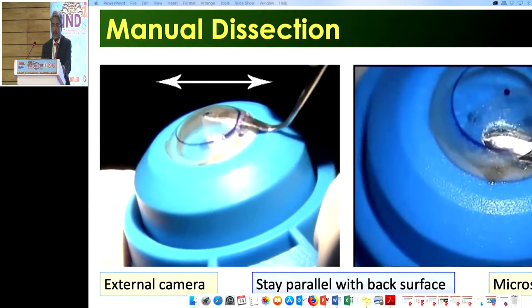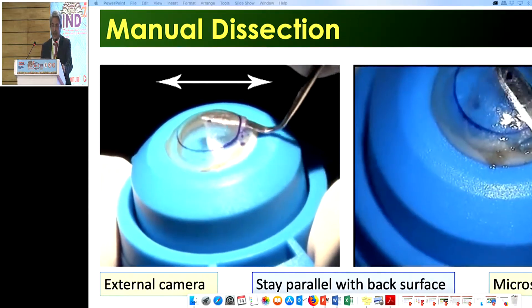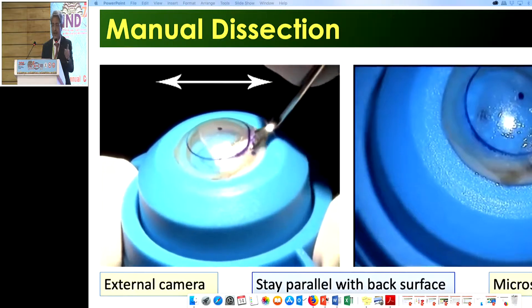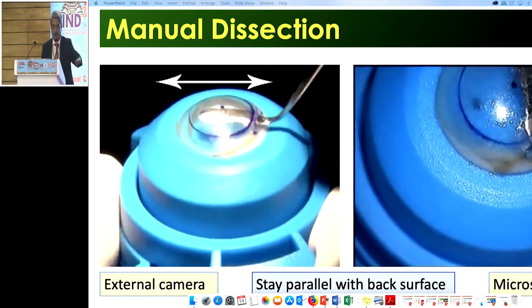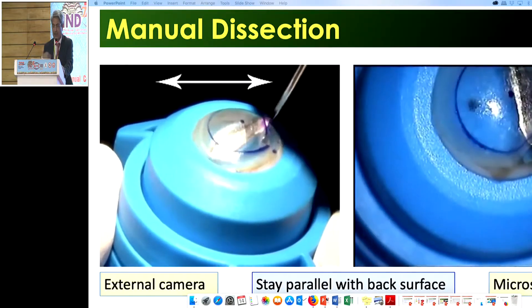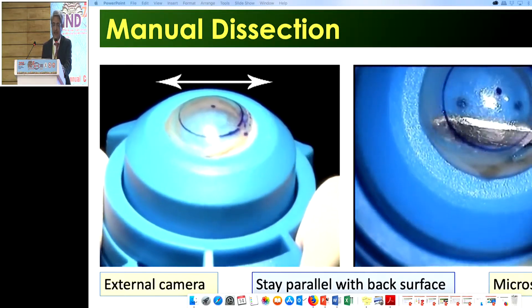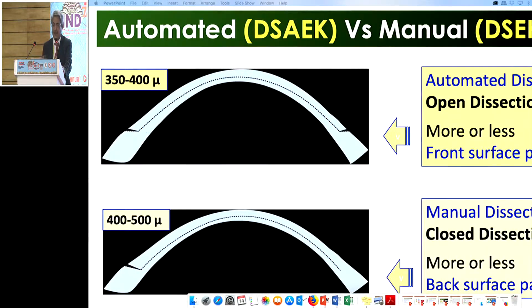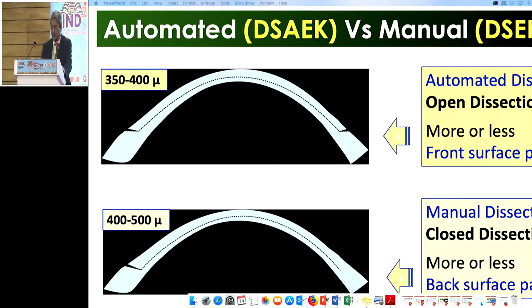Centration and holding of the artificial anterior chamber in your left hand is very important. The white arrow shows the horizontal line about the plane, and you rotate the hand when you reach the other end — like six o'clock from your side. Always try to stay parallel with the back surface and your dissection will be perfectly fine. Automated dissection will be an open dissection, but manual dissection is always a closed dissection through a 4.5 to 5 mm limbal incision, and it is back-surface parallel.